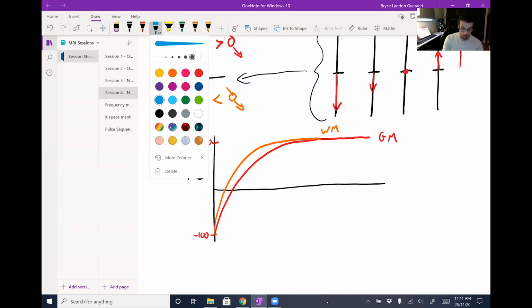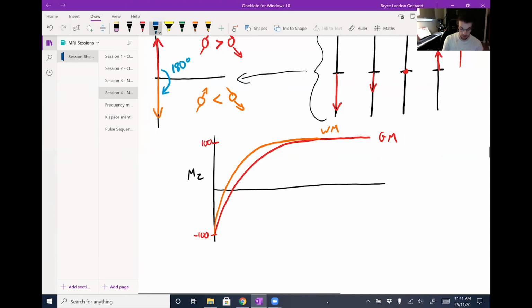And then if we consider water, water has a much slower T1 recovery time, right? So its curve is going to look something more like this. I'm going to try drawing that again. That one was a little wobbly, not that it matters to anybody. I'm actually going to draw that even more accurately. So these two have reached 100, whereas the water curve probably won't even be there by the amount of time that we're looking at here.